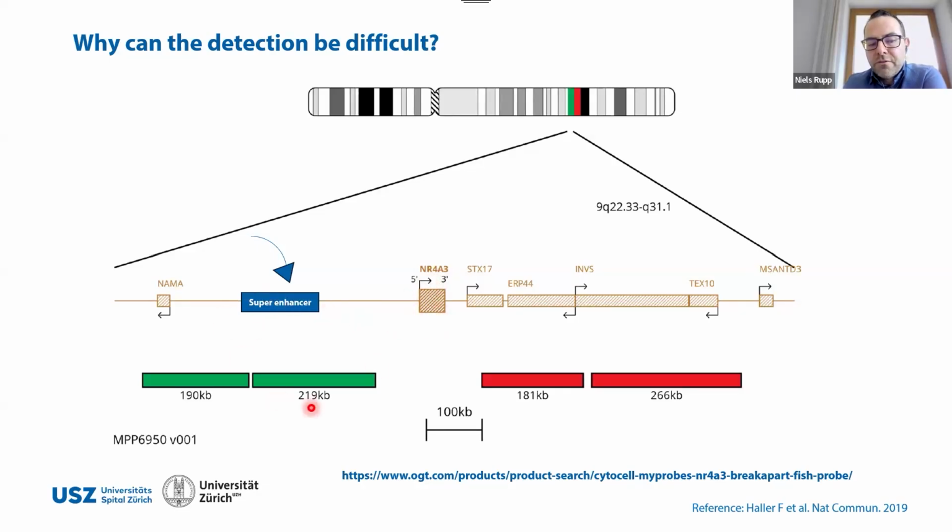And here you could see, for example, a positive FISH. If the breakpoint were here, then you would probably have a dislocation of both probes. But if it were here, for example, you would not even see a positive FISH. So the FISH would be negative. The NGS would also show no translocation.